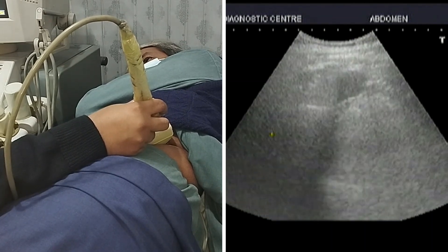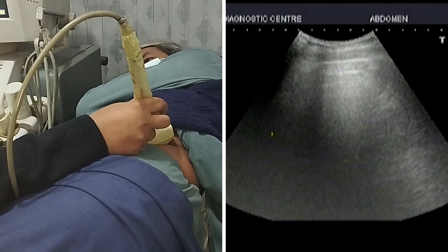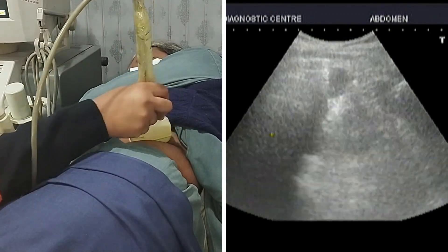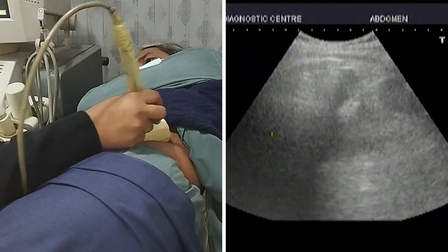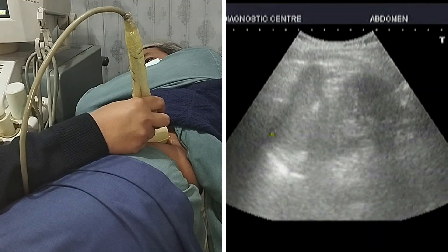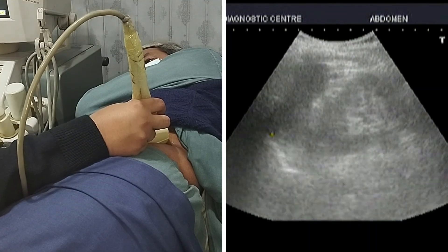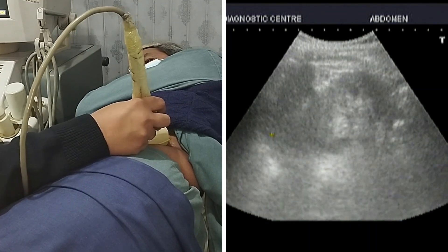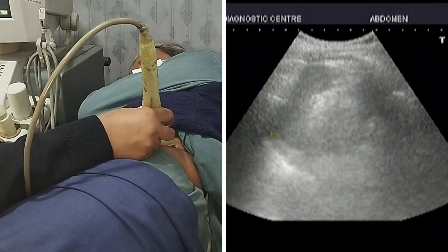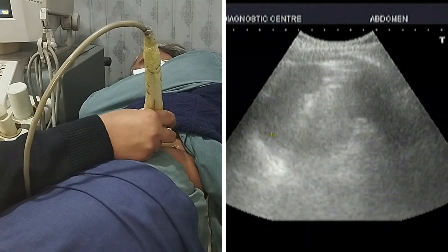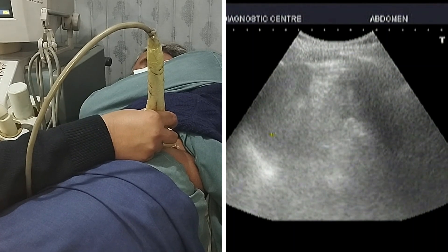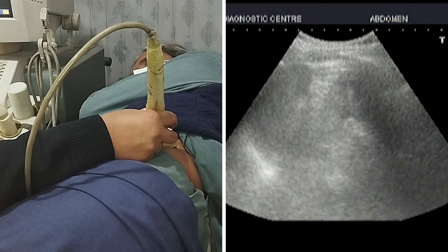I will ask the patient to take a deep breath. When the patient takes a deep breath, the spleen moves downward. But in this case it is being relatively obscured by rib shadow, which is normal. So I will ask the patient to keep on breathing normally. I will push my probe a little bit downward and now you can see that the spleen is visible in its entire length and width.